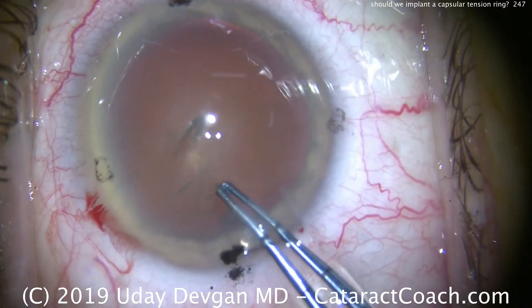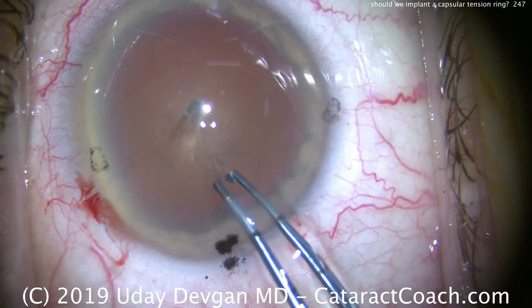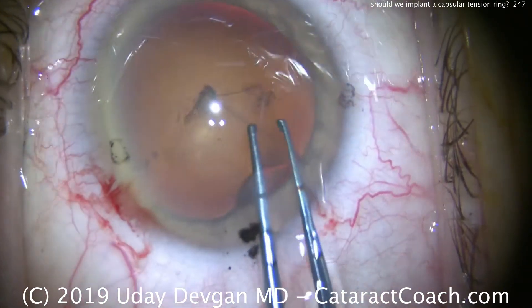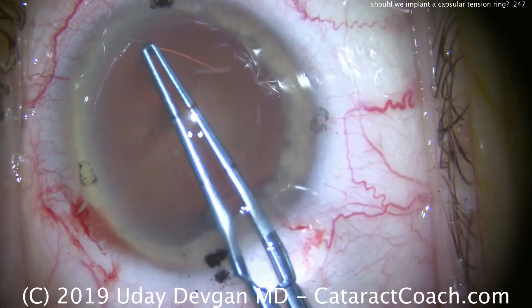Now as we tear the rhexis, it looks okay and there seems to be sufficient support. But of course, the zonules are globally loose — not focally. There's no prior trauma; they're all just a bit loose. The patient doesn't have pseudoexfoliation, but the patient is quite elderly.